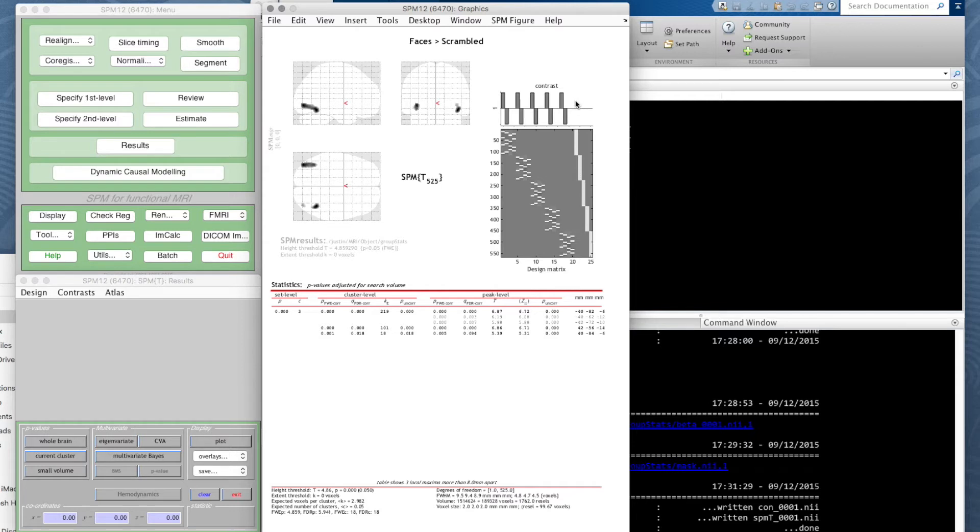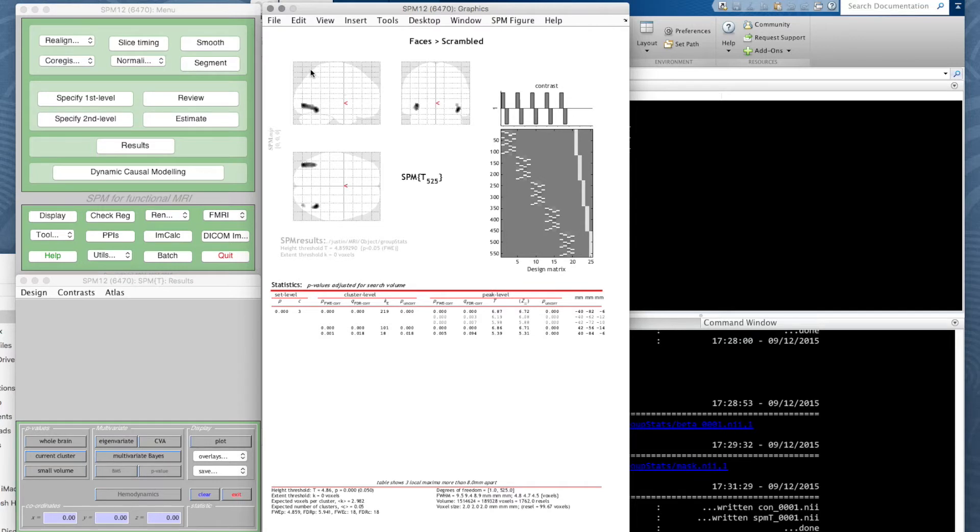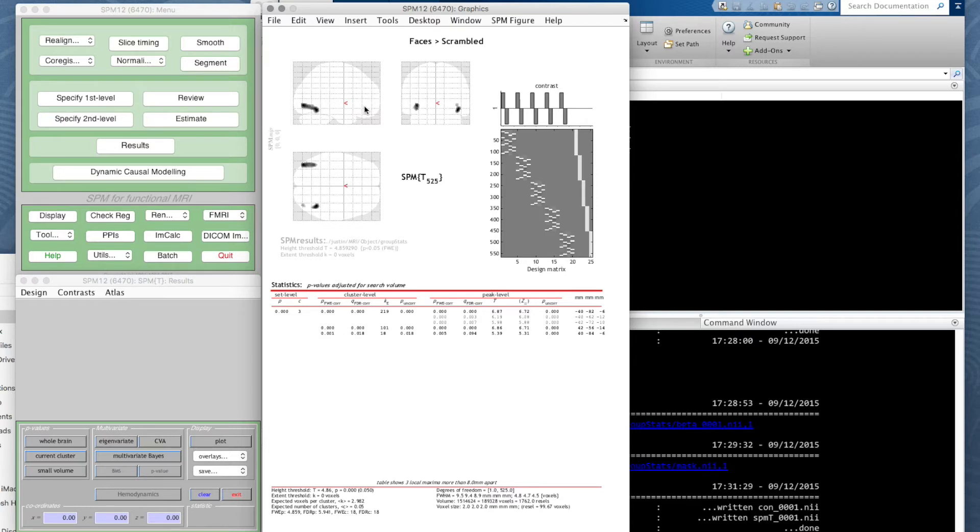We have our design matrix here, we have the contrast faces minus scramble—these are the five faces conditions for the five participants and the five scrambled conditions of five participants. This is a so-called glass brain view. Each view will show us all voxels going into the screen.